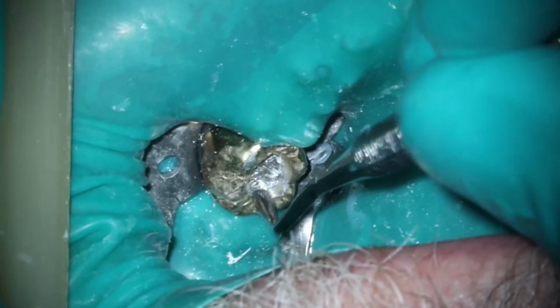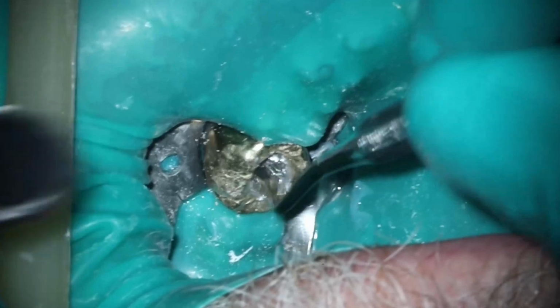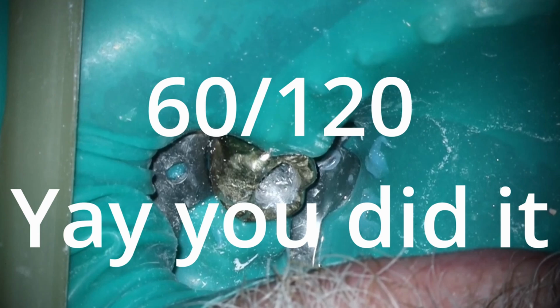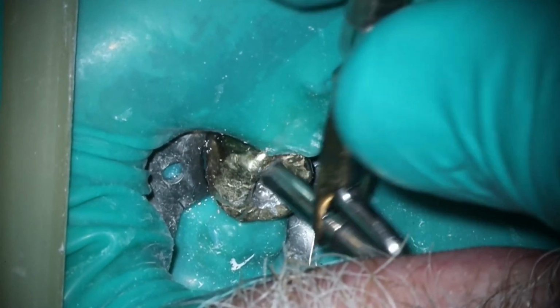So we're just finishing up the case here. One thing I forgot to mention is I have found that the B&L, they have this blue plugger. It's, I believe, a 70 and 140, I think. I'll put down in post what the actual numbers are, but it's the blue one. And the stainless steel stiff side is about the size or diameter of a traditional amalgam condenser. It's just much longer. And I've been using this now for probably 10 years, it is the best way to place amalgam really far down inside the canal itself. Actually, I think it's a 6120 because it's a 7140. Yeah, because my normal one is 3570.